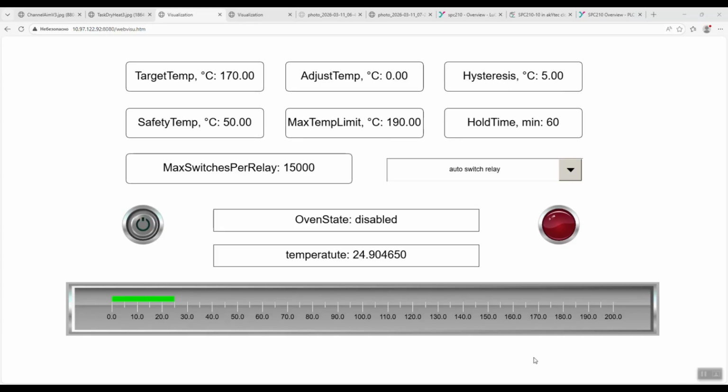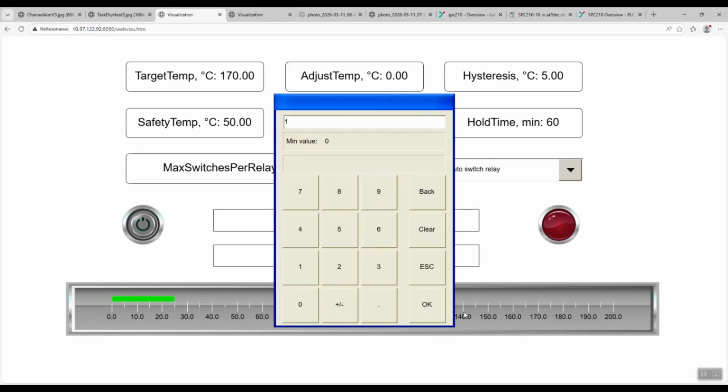Now let's take a look at the graphical user interface that I created using the visualization editor built into the CODESYS environment. I'll demonstrate how the prototype works. I'll set the target temperature to 170 degrees and the holding time. I'll set it to 1 minute so we don't waste your time.